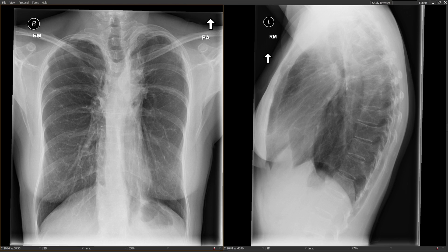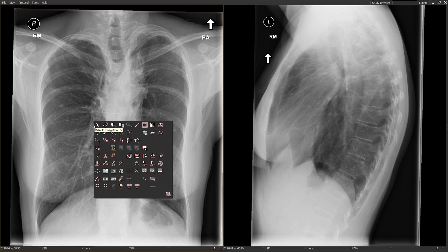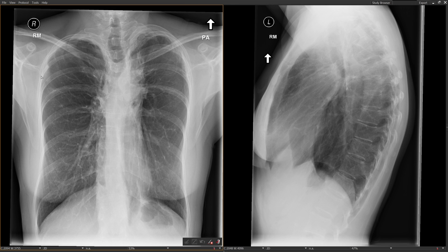Let's first start with mediastinal radiation. I have this example here of a patient who received mantle field radiation. The term mantle field radiation describes the area of the body that was radiated, and it's not really used that much these days because the field of radiation is quite large. Today the radiation fields used to treat lymphoma are much more targeted. But mantle field radiation is something you'll still see because patients received it in the 70s and 80s, and you'll still see those patients getting imaging today.